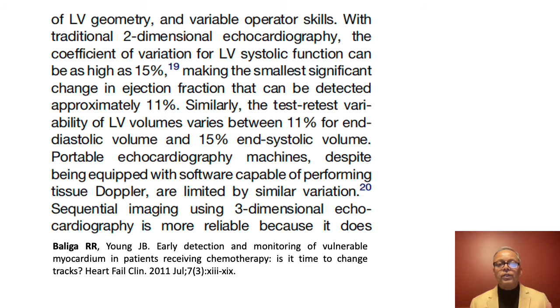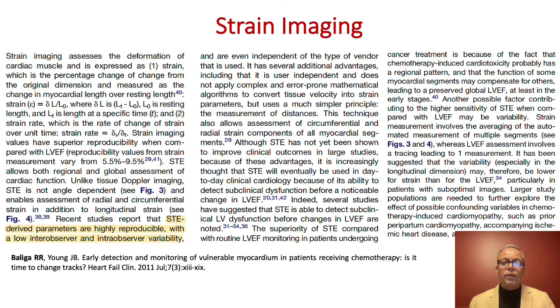Another option which is emerging is 3D echo because it's a lot more reliable. Strain imaging has also emerged as an important modality in our toolkit. Strain imaging has superior reproducibility when compared with LVEF.